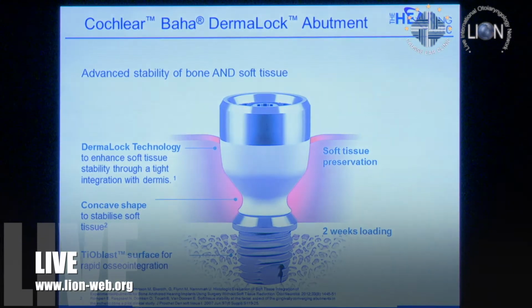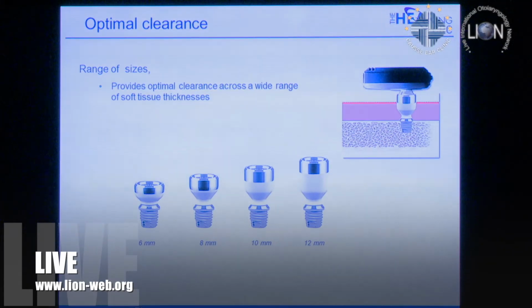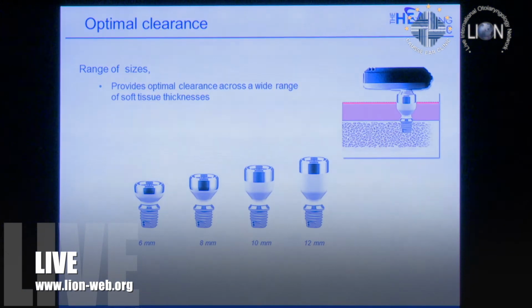And since then, the companies have produced better percutaneous prostheses. The screw fixture is improved to have special coatings, titanium coatings on the fixture, which allow more rapid integration and greater stability. And in theory, the abutment itself has better soft tissue interaction, although, to be honest, I don't think that is a significant factor. I think what makes the difference is optimal clearance from the skin, and that the abutment itself should have at least 4 millimetres clearance so that you're not traumatising the adjacent skin. And I'm not entirely sure that the hydroxyapatite coating makes any difference.